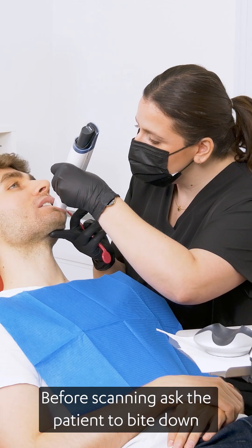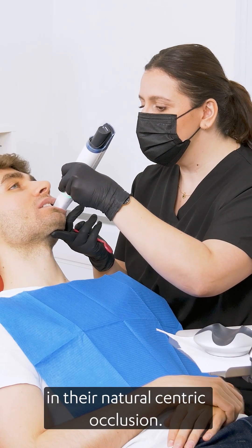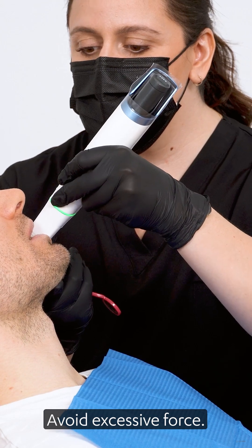Before scanning, ask the patient to bite down in their natural centric occlusion. Avoid excessive force.